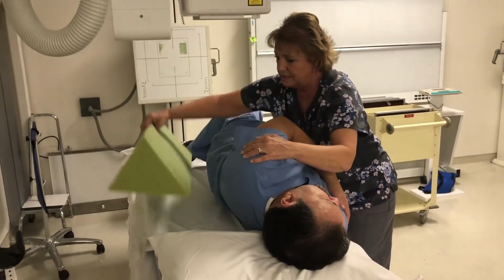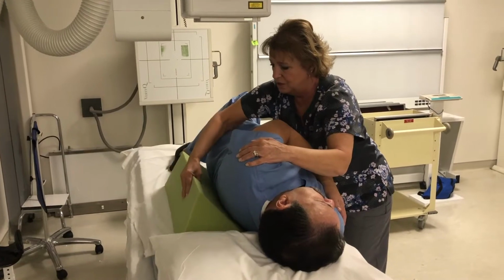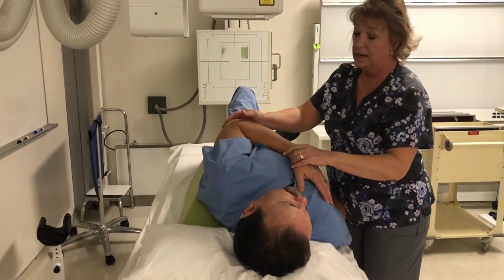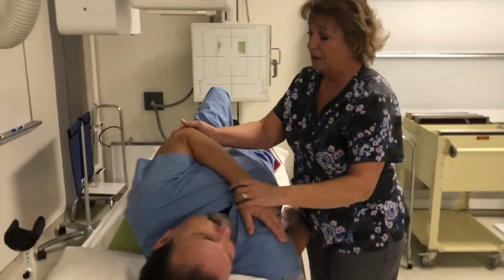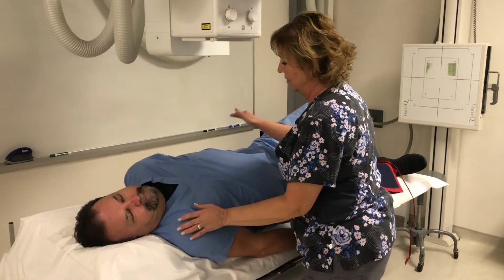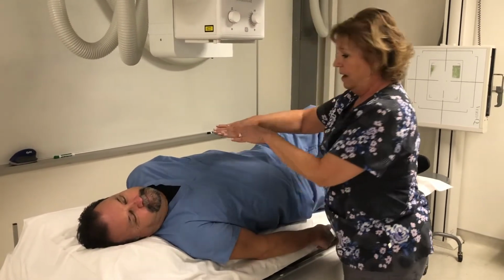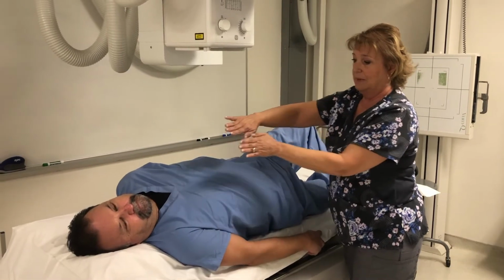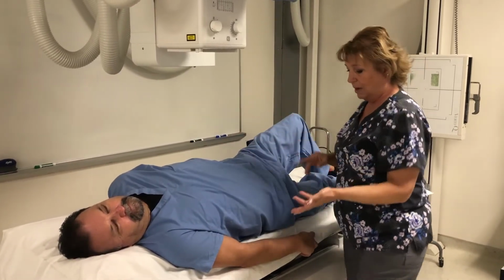And I'm going to place the 45-degree angle sponge right under his back and then have him just rest against that. Now he can keep his arm up here, it's out of the way, or he can put it back down by his side, whatever is more comfortable. Now I've tipped him 45 degrees, but he's still in alignment. He hasn't shifted his shoulders or his pelvis.